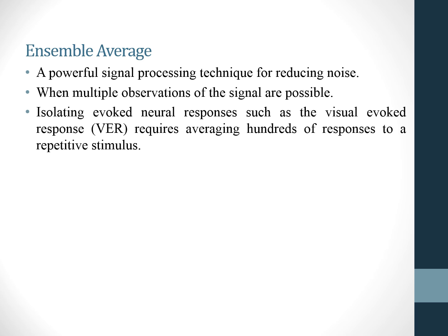So the type of signal of which we record multiple observations is visual evoked response or visual evoked potential. Isolating evoked neural responses such as visual evoked response requires averaging hundreds of responses to a repetitive stimulus.